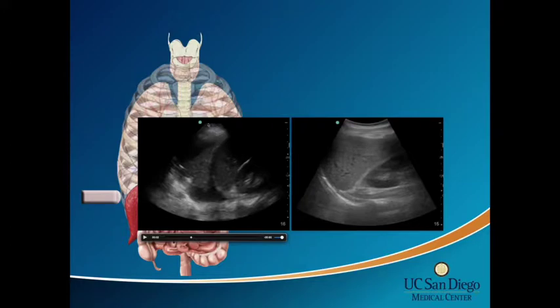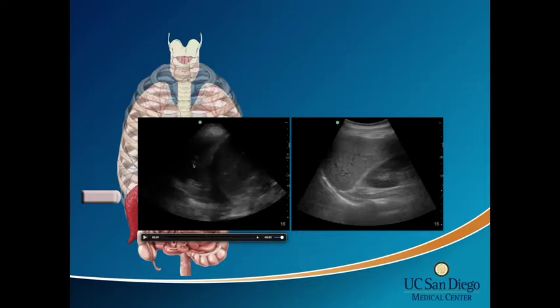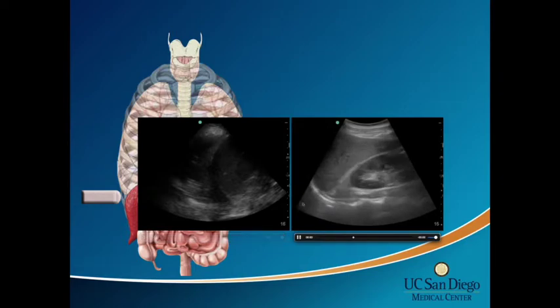And so what's happening is now the beams have something to shoot through. They can shoot through the lung because it's not filled with air, and they can shoot through the pleural effusions, and it shows you there's more spine. And up here, there's some more lung. This is probably pneumonia, pleural effusion, some atelectatic lung there. That's all abnormal. And the normal person just basically has mirroring of the liver there.